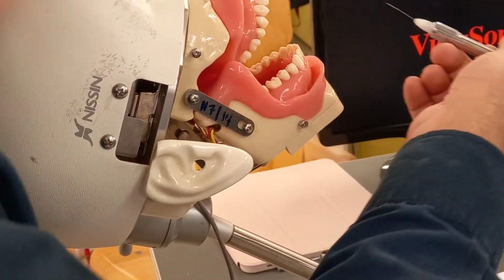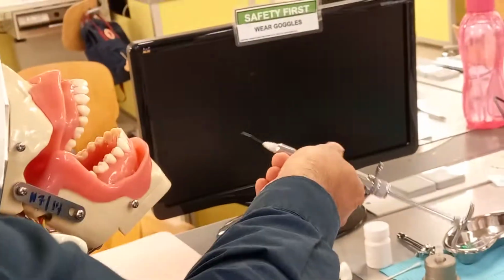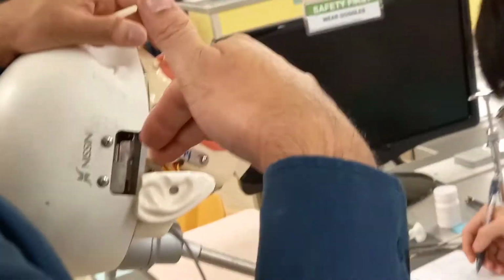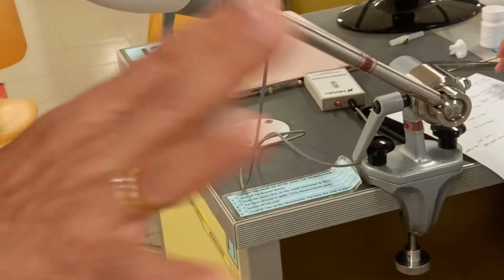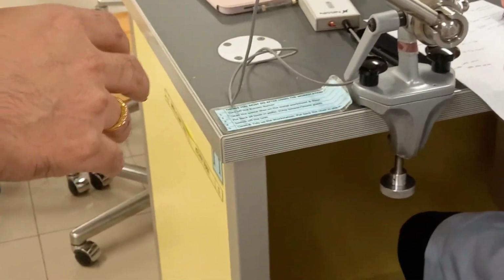Now try that, all of it. Cleaning with the suction, removing the saliva, wiping, then applying topical, then removing the topical. If you want, the patient can gargle after that. Those steps are the same whether it's a nerve block or infiltration. It doesn't change. Only the depth of your needle and the angulation of the needle change.